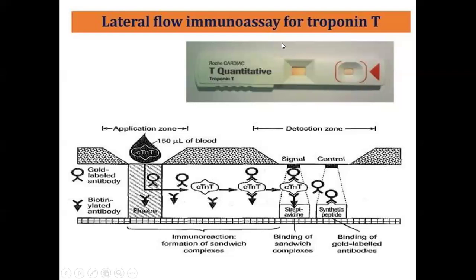Troponin is a molecule which can be analyzed with respect to a biomolecule, as there is some immunological reaction being given. This is a sandwich type of assay.